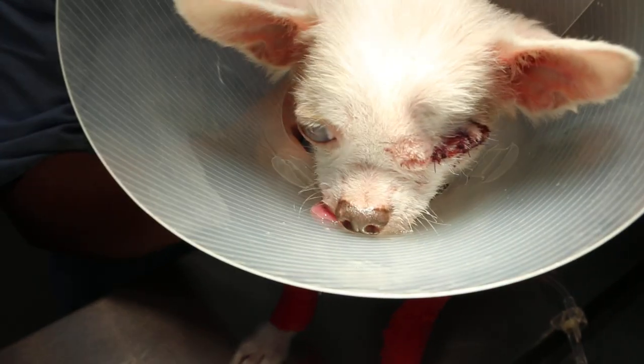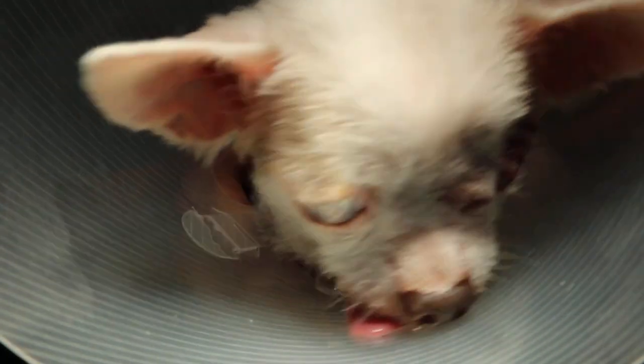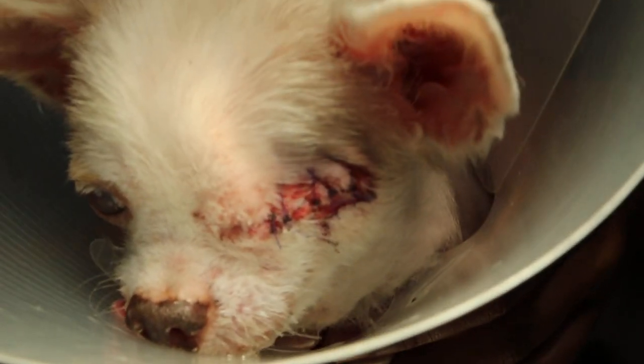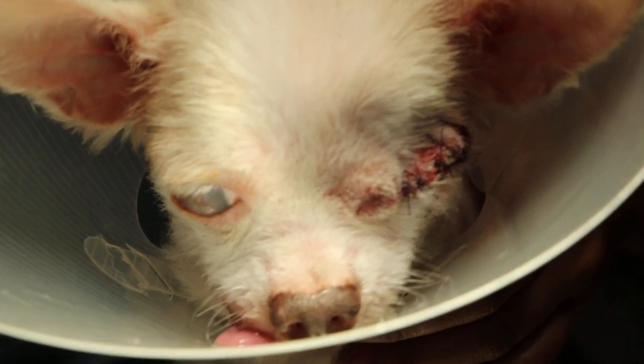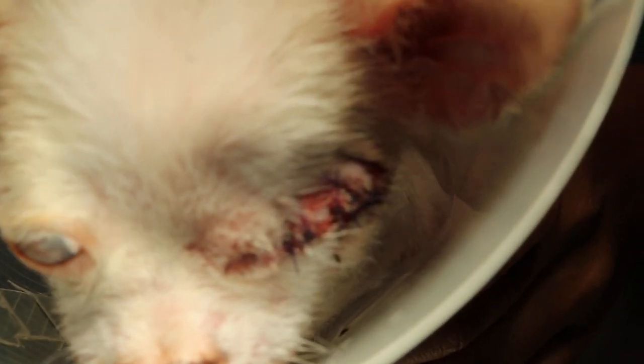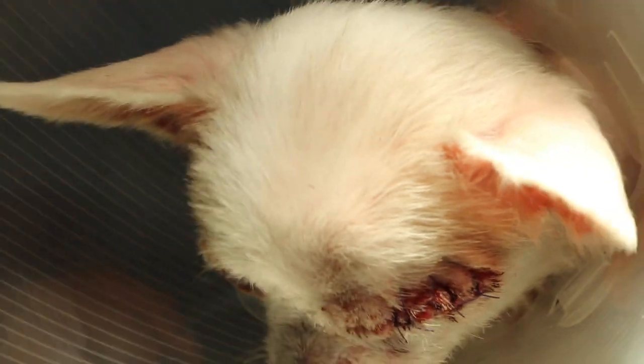Today is 5th November 2018. This is a video to show how this dog's surgery has been performed. This surgery is called enucleation — removal of the eyeball due to severe injury and pain. I'm describing the surgical procedures. This surgery was done about one and a half hours ago.